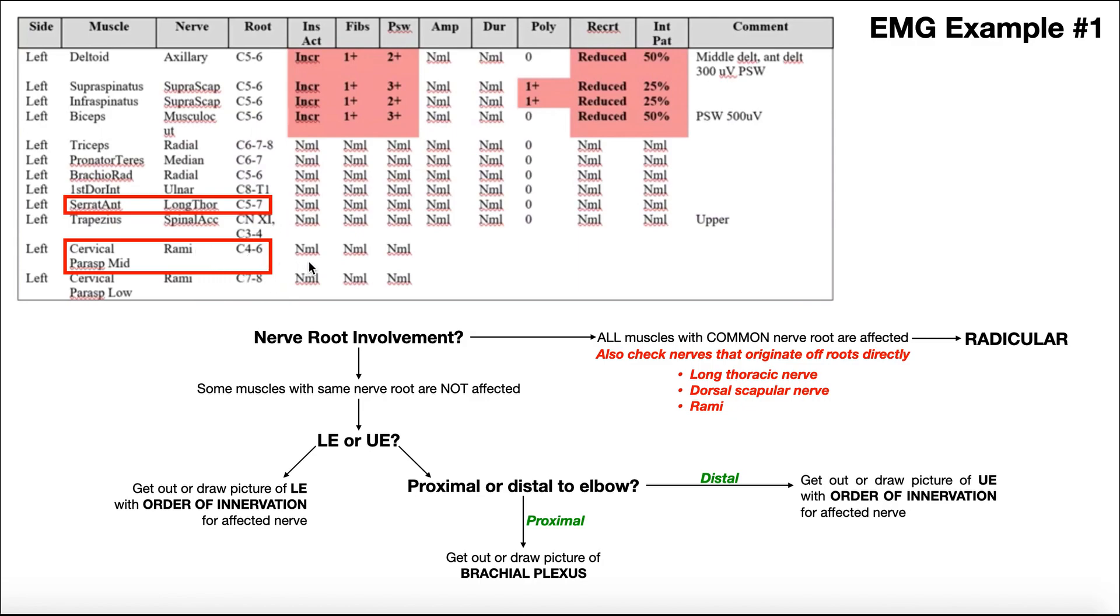If these rami and long thoracic nerve and even dorsal scapular nerve were abnormal, that would strongly rule up a radiculopathy. So given that these are normal, I have now ruled out a radiculopathy.